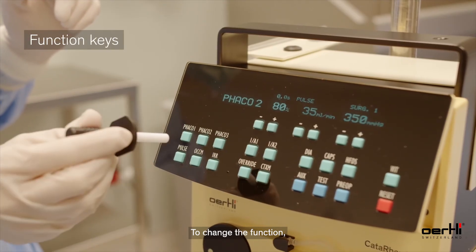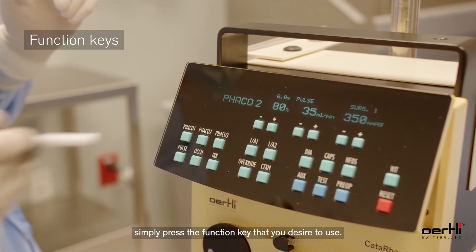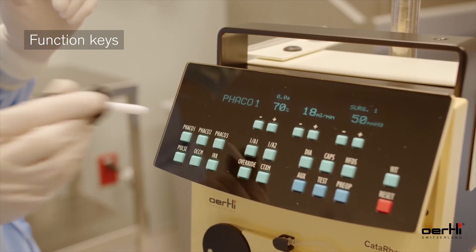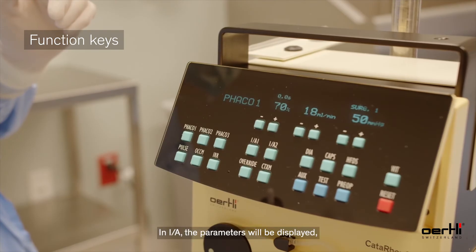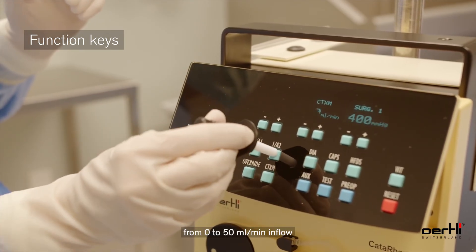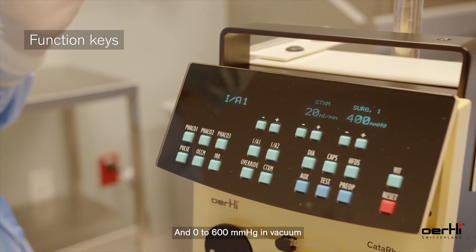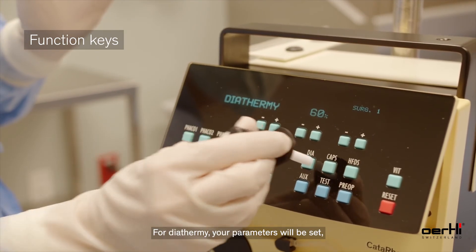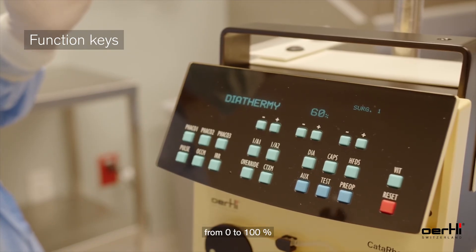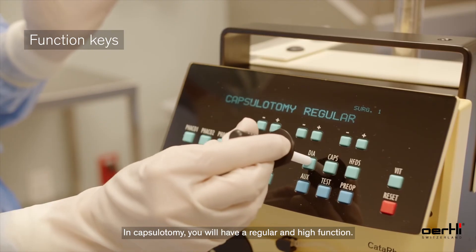To change the function, simply press the key that you desire to use. In IA, parameters will be displayed from 0 to 50 milliliters per minute in flow and 0 to 600 millimeters of mercury in vacuum. For diathermy, parameters are displayed from 0 to 100%. In capsulotomy, you will have a regular and high function.